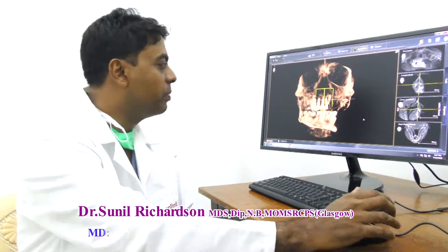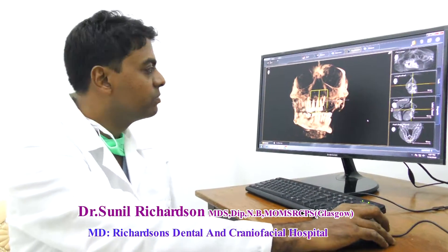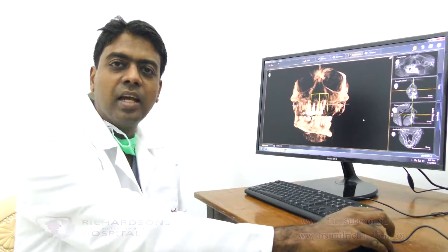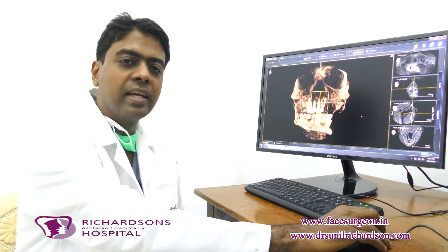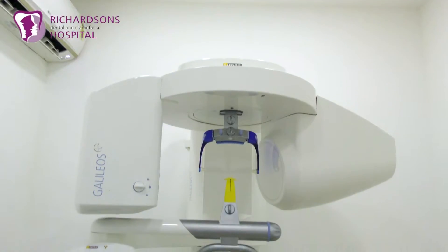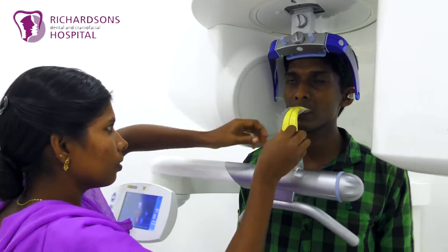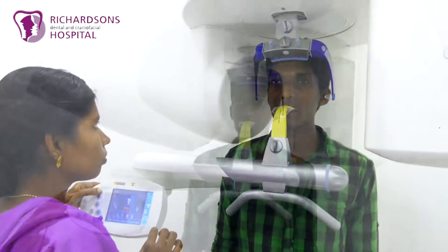This is a patient who has come to us recently. He has had a history of cancer surgery on the maxilla and mandible, and we had taken a cone beam CT scan on the latest, dated 15.3. On the various views on here, you can appreciate the problem that he has.